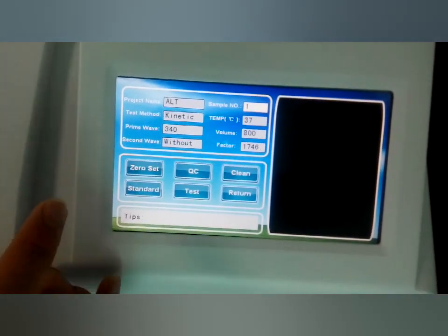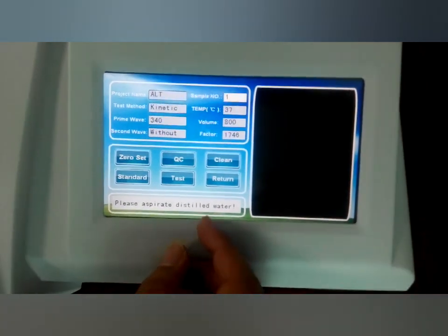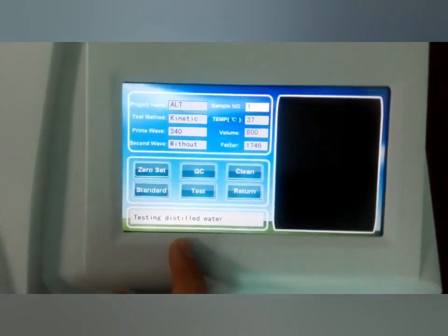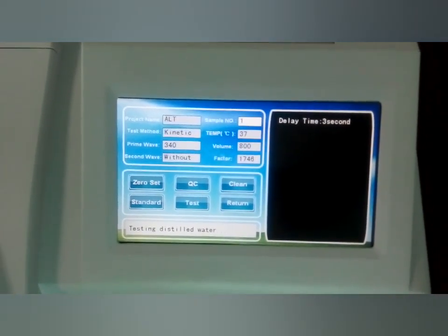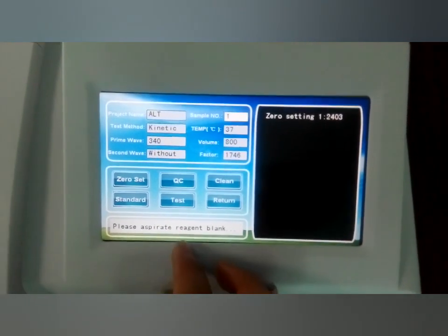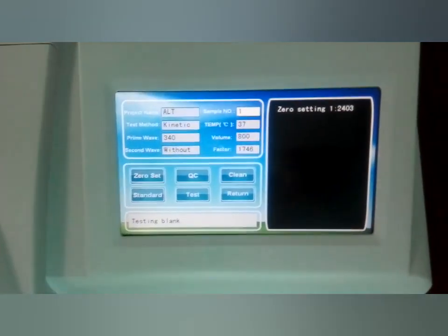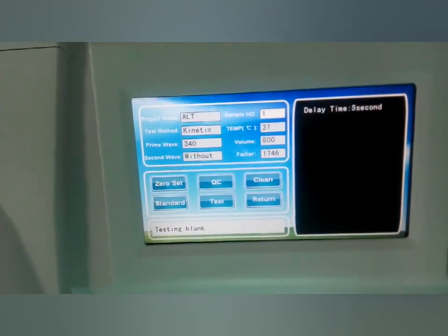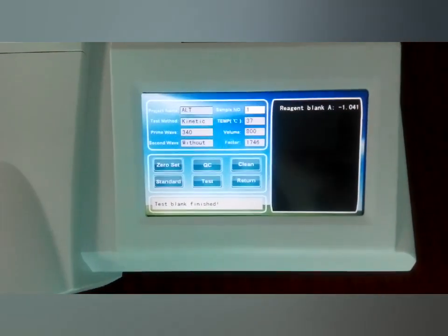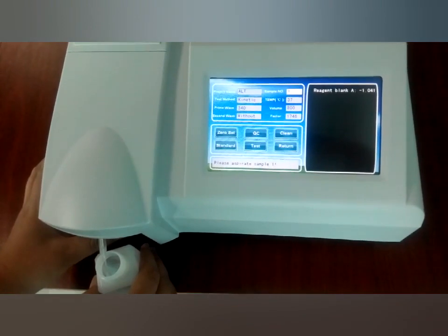First, we should do it according to the reagent menu — do the zero setting first. Now it shows 'please aspirate' these two words. We just do as it shows us. Now it is showing 'testing'. After that, it shows 'please aspirate the reagent blank.' We just do as it shows and aspirate the reagent blank. After finishing this, we can do the test. Use the reagent — the ALT reagent — and just click test and aspirate the reagent sample.